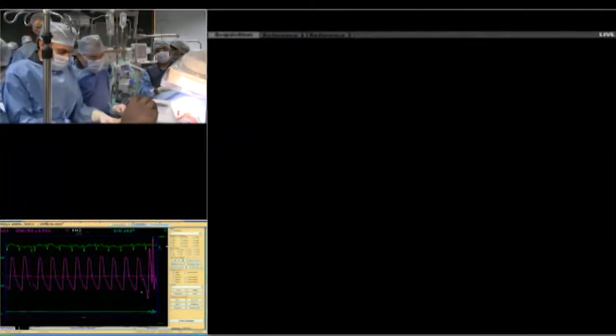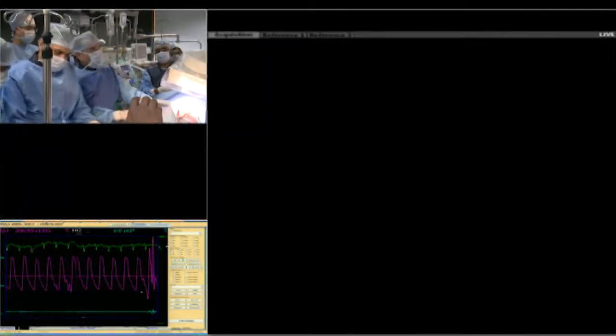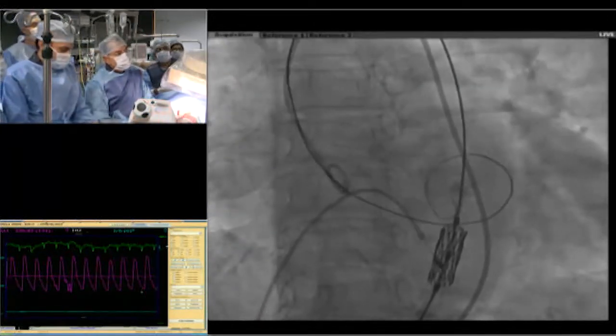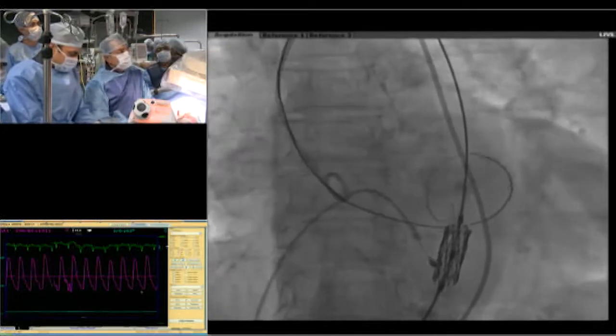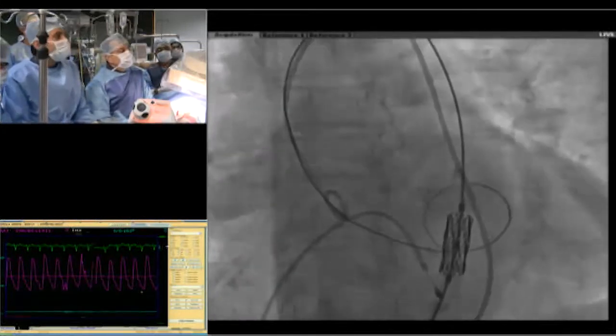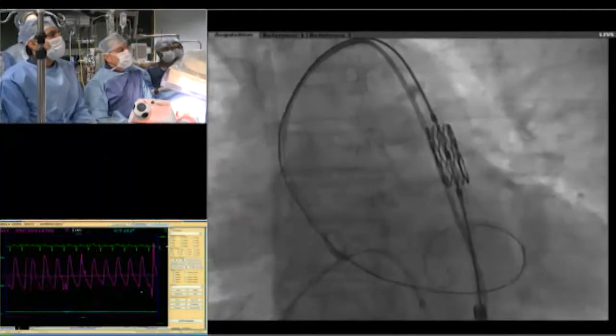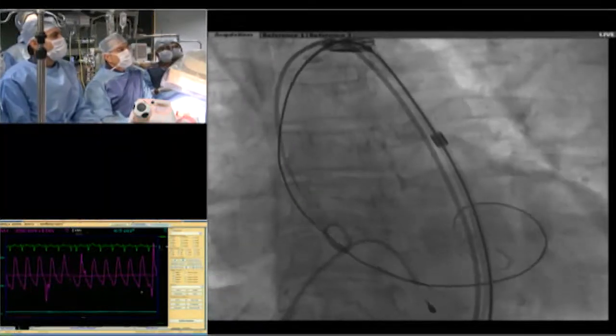So now you would be moving and I would be advancing. Is that right? Let's go ahead. So I'm advancing this. Show us the arch, please, now. Concentrate. Go ahead. Leave the wire. Don't touch the wire. You control the wire.